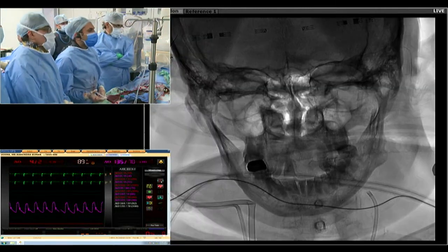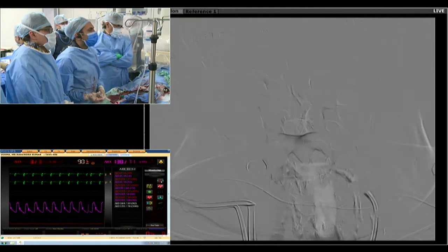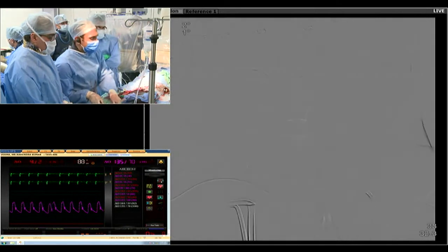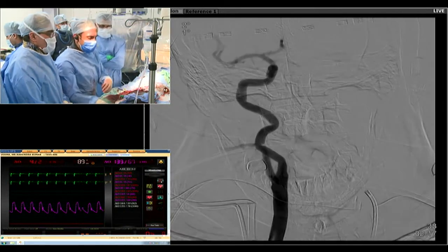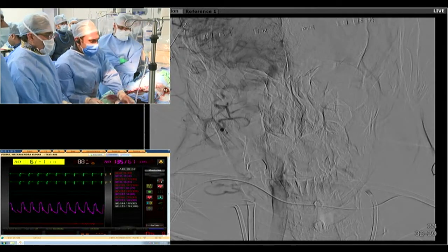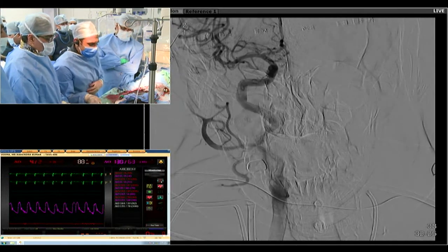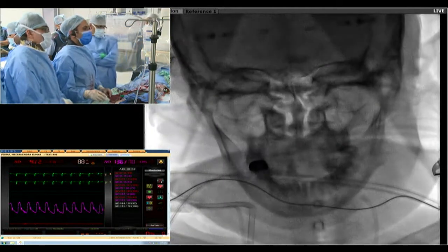Do you always do a brain angio after TAVI? No, not always. In this particular patient, as I said, this patient has an LV apical clot, and we just removed the spider filter. So we don't have a Sentinel device in India. This is just for this one particular patient we are doing it.